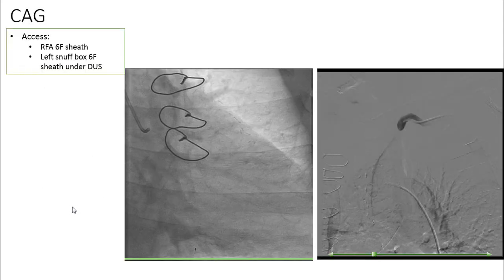The patient was a candidate for coronary angiography. We had one access from the right femoral artery with a 6 French sheath, and another 6 French sheath on the left snuffbox under Doppler ultrasound — the area had no pulses, so access was done only with the aid of ultrasound.